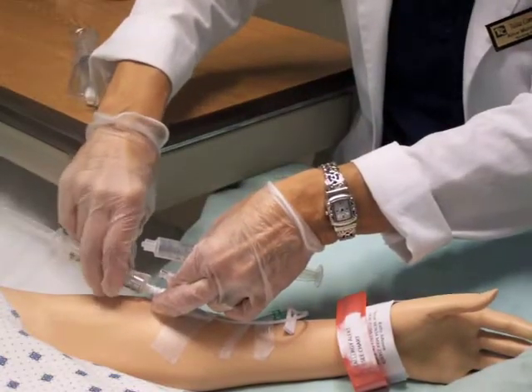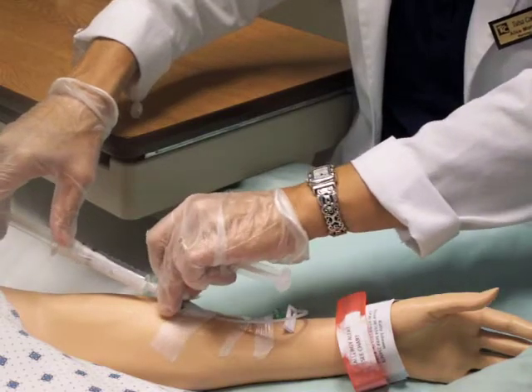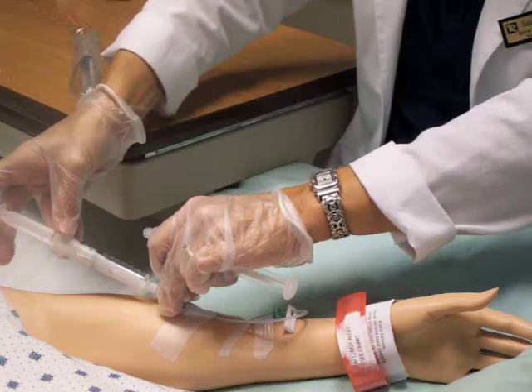Administer the medication by IV push at the recommended rate using a watch or digital readout to time the medication administration. This ensures safe drug administration because a too rapid injection could be dangerous.